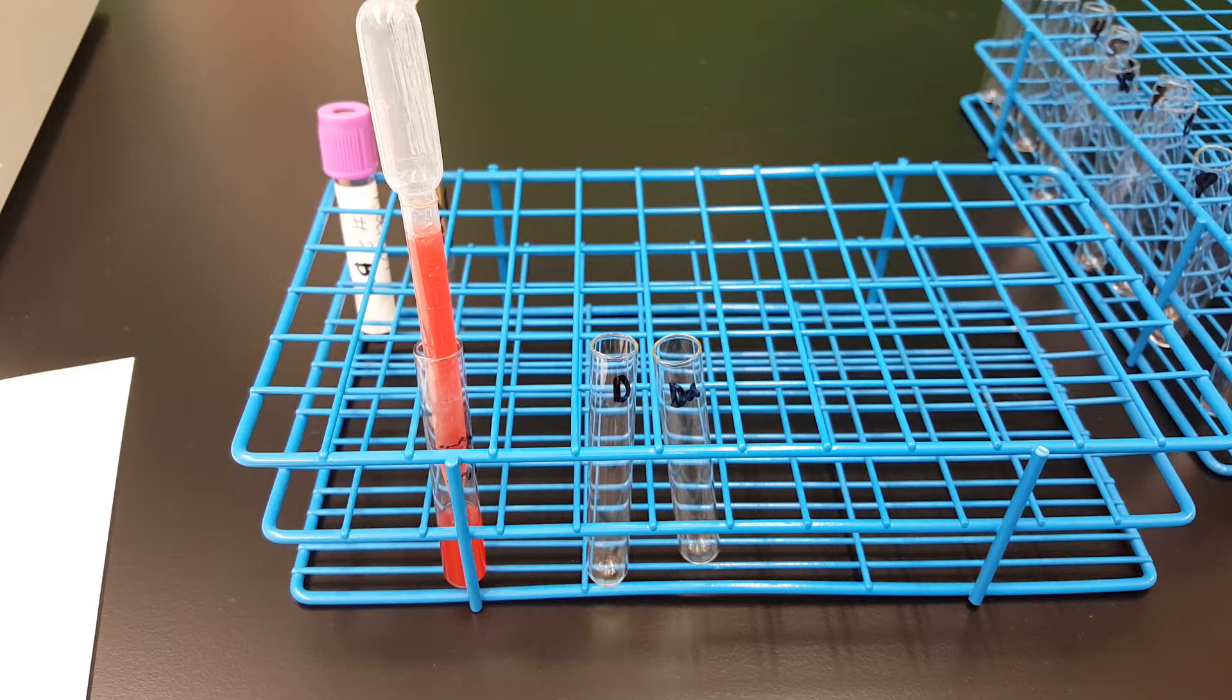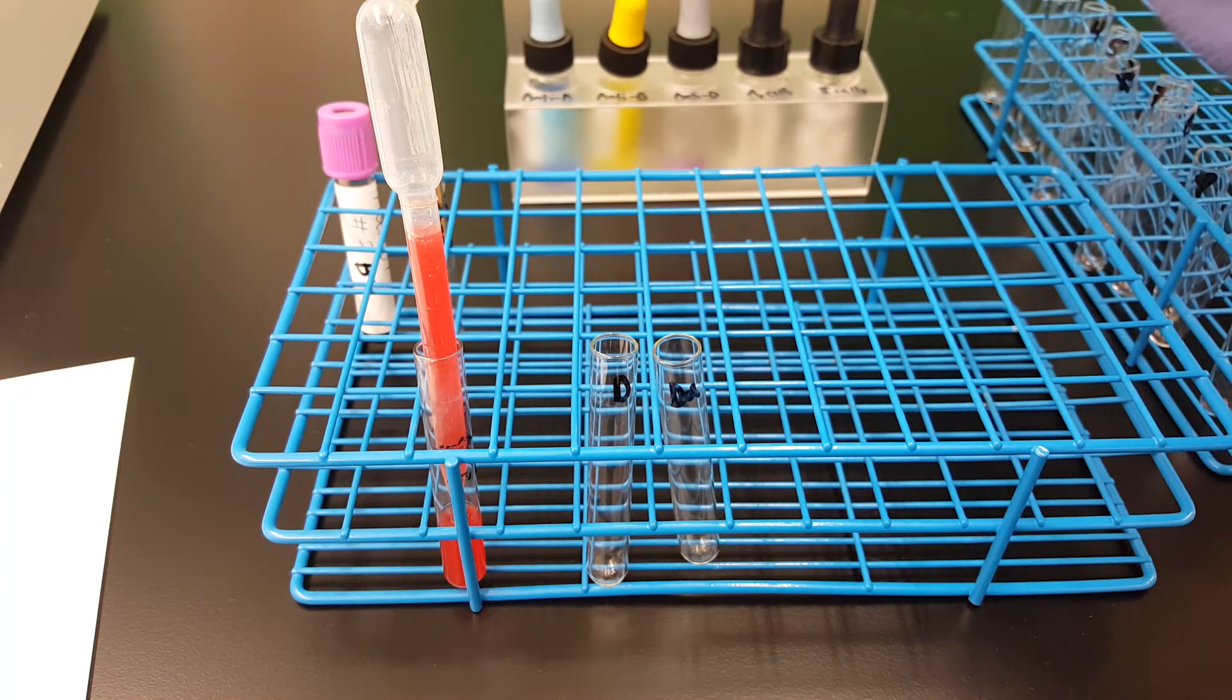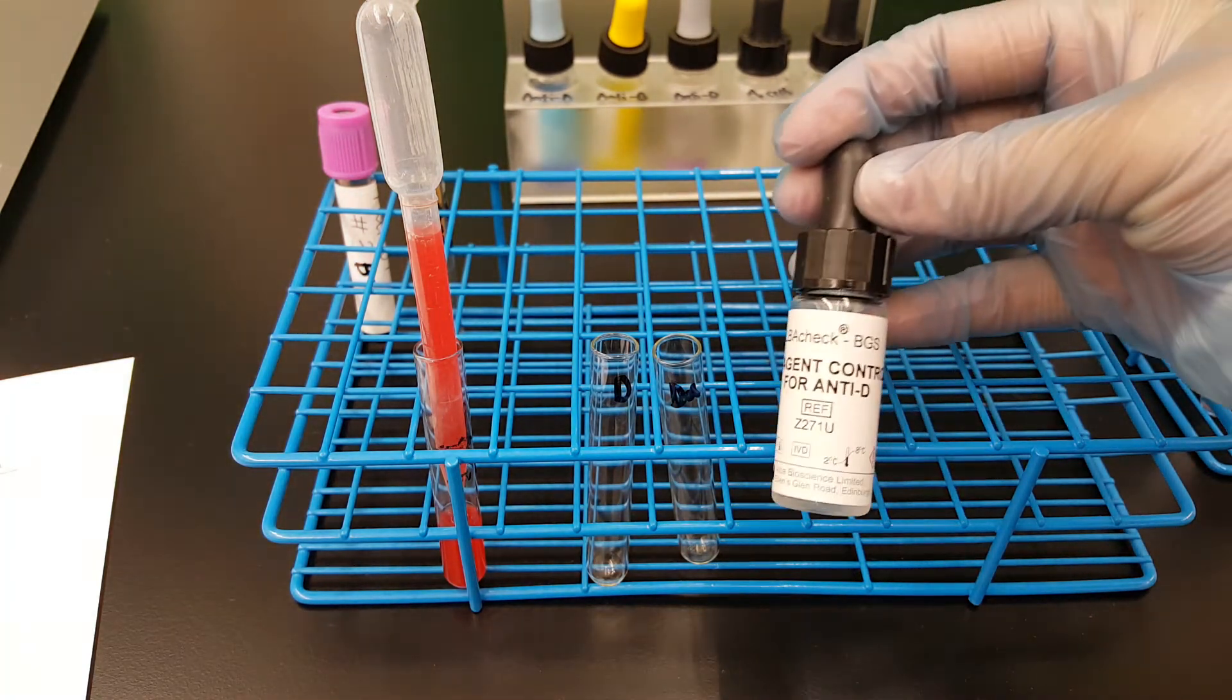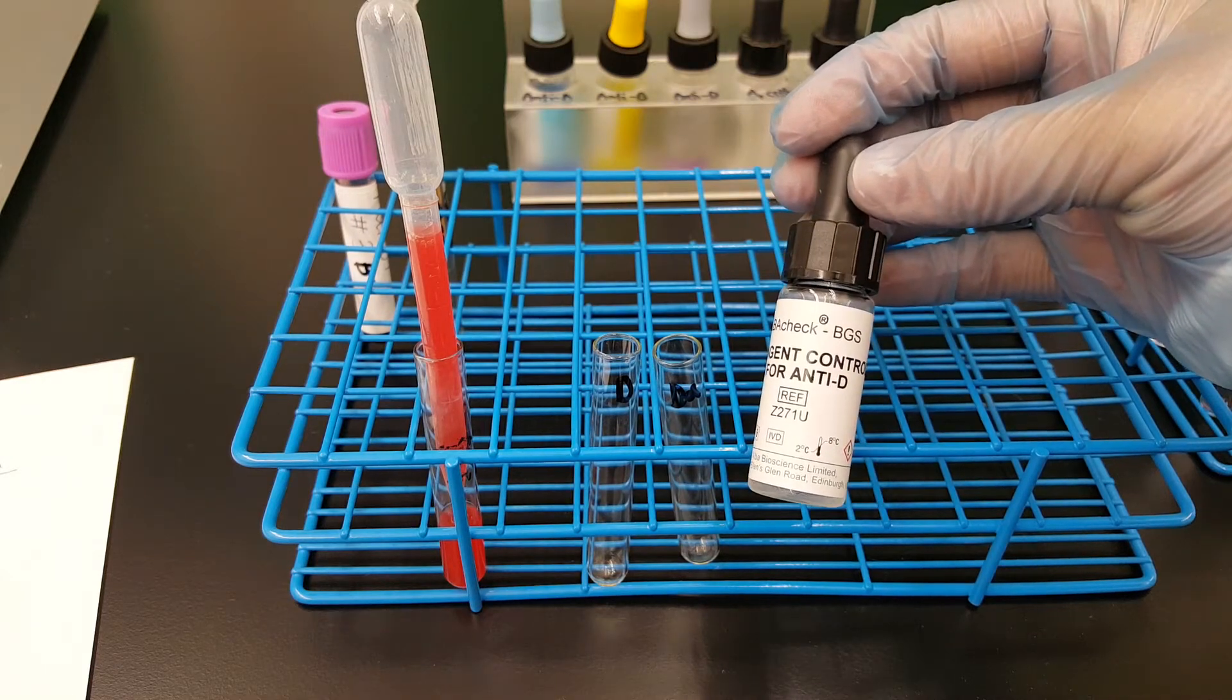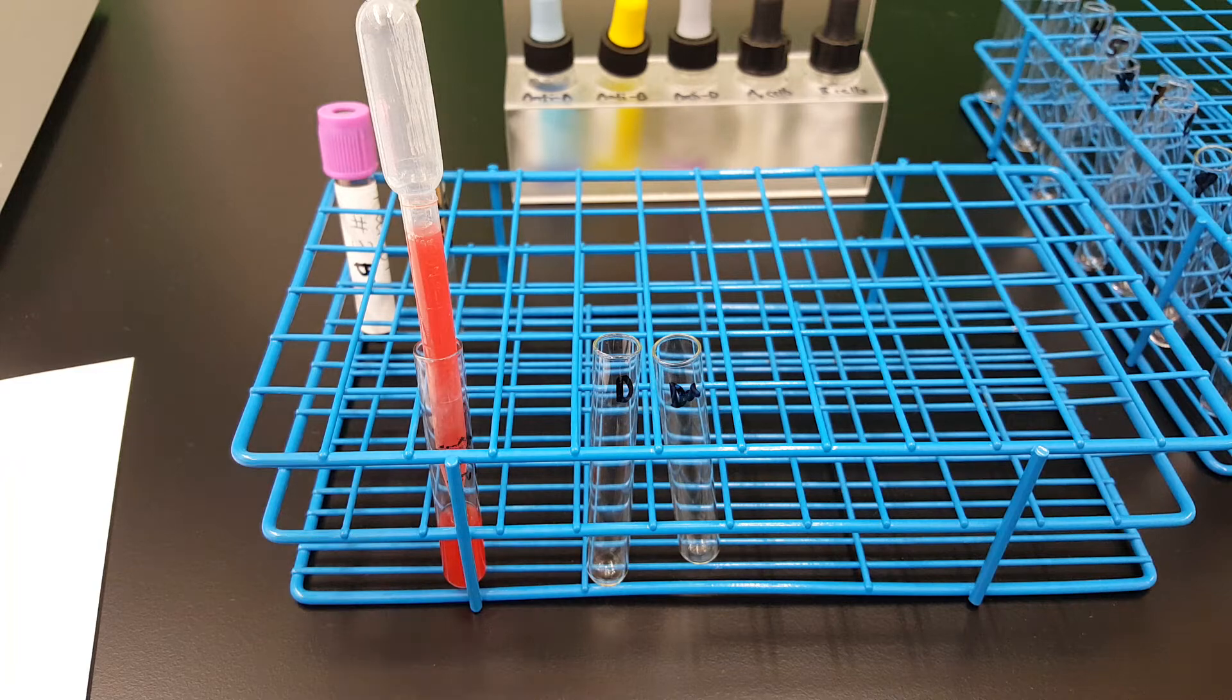What we're going to do is test what we tested previously with the ABO. We're going to do the D that we did before, but this time we're going to add the anti-D control reagent.